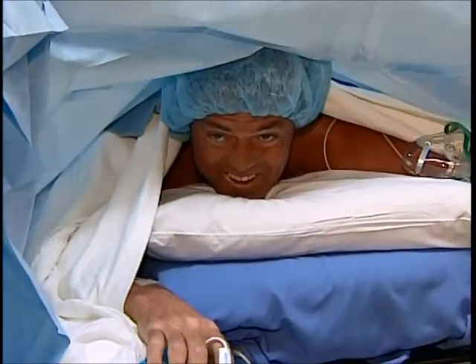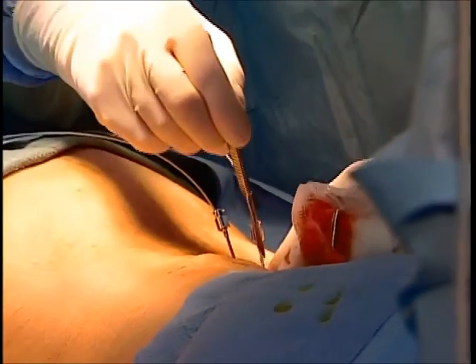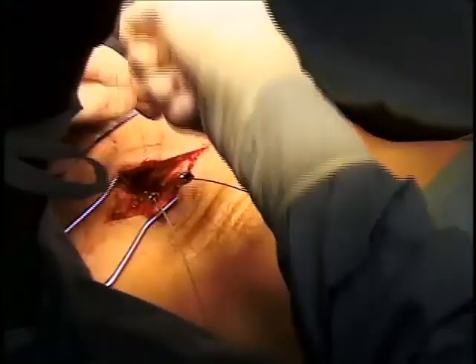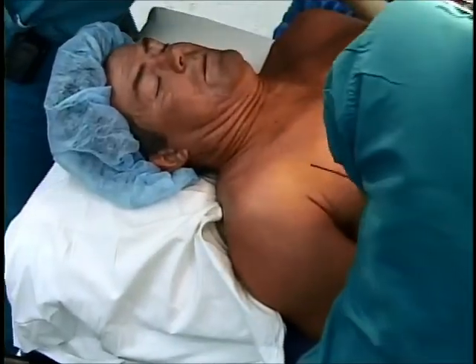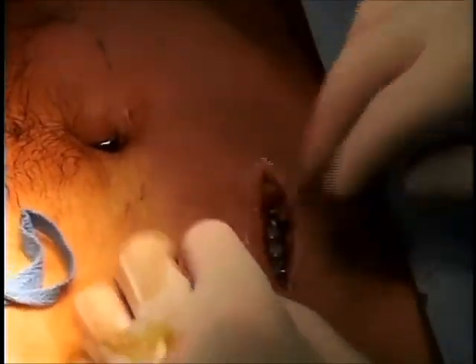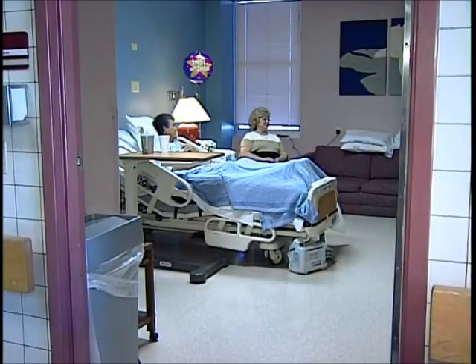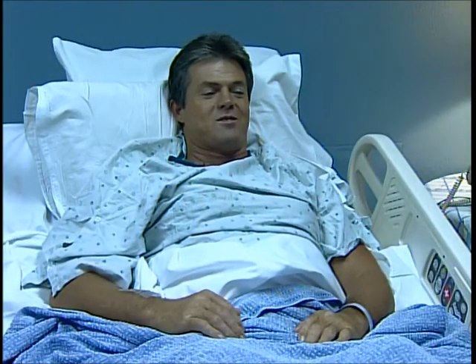Bill has been in surgery nearly 3 hours. Next, he is put under, and an incision is made so the stimulators can be anchored in place. Finally, the leads from the electrodes are run under the skin to a receiver, which is inserted in his abdomen. The operation takes about 4 hours from start to finish. 24 hours after surgery, Bill's spirits are high. How you feeling? $1 million, ready to go.